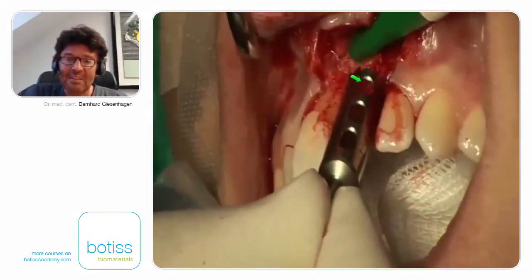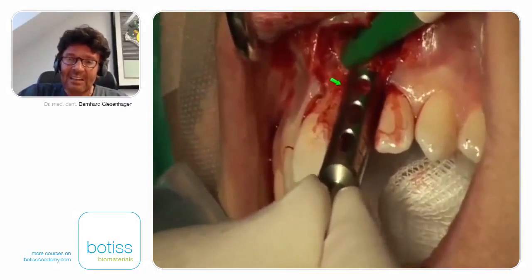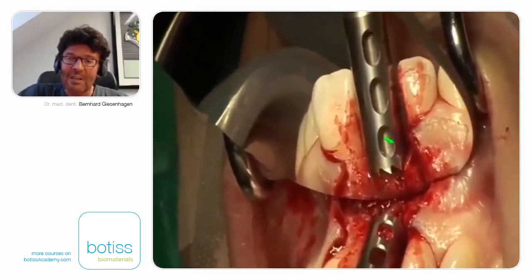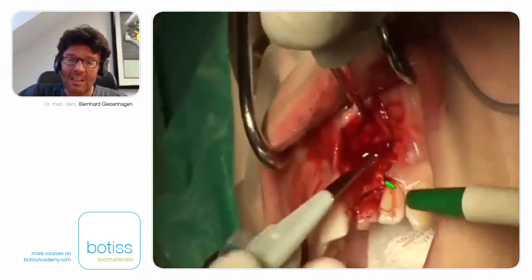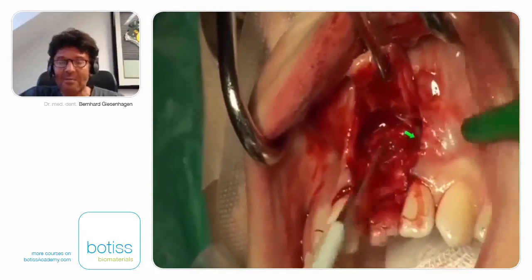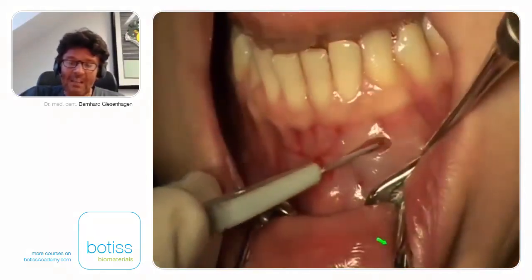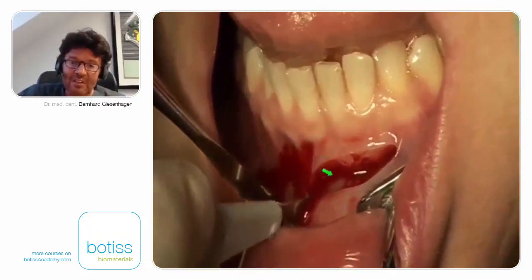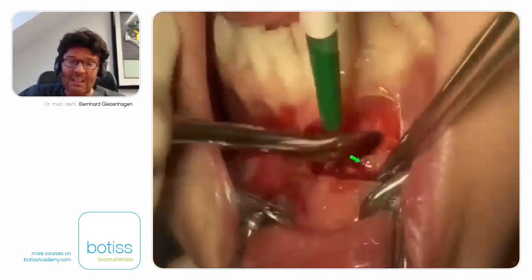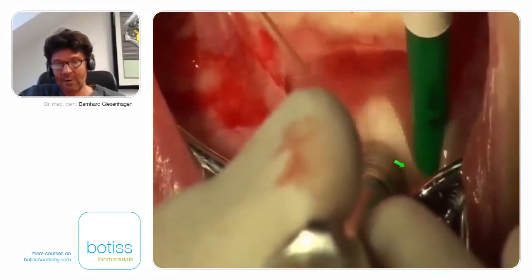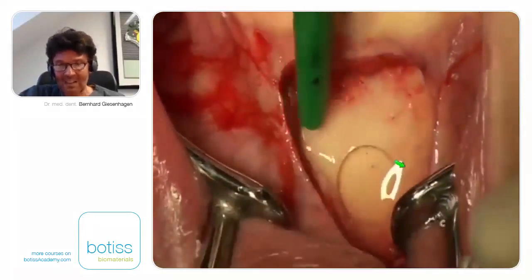I measure the defect with the trefine mesiodistal distance. If bone is covering the roots of adjacent teeth, I recommend leaving approximately one millimeter of distance. Then I release the flap with a periosteal incision right after raising the flap, because a lot of bleeding comes from the periosteum which stops later during suturing. In this case I go to the chin area with a special flap design to harvest bone, and I mark only the position of the ring — going only half a millimeter into the cortical bone.